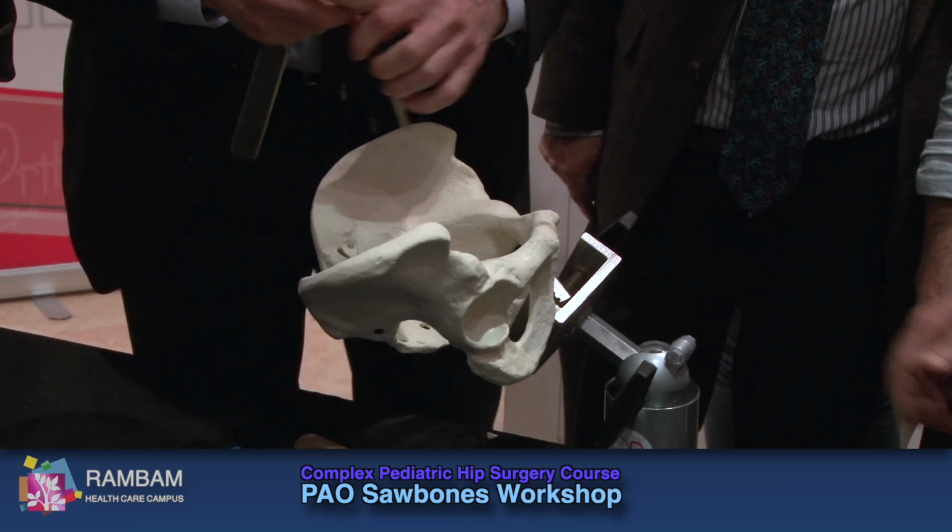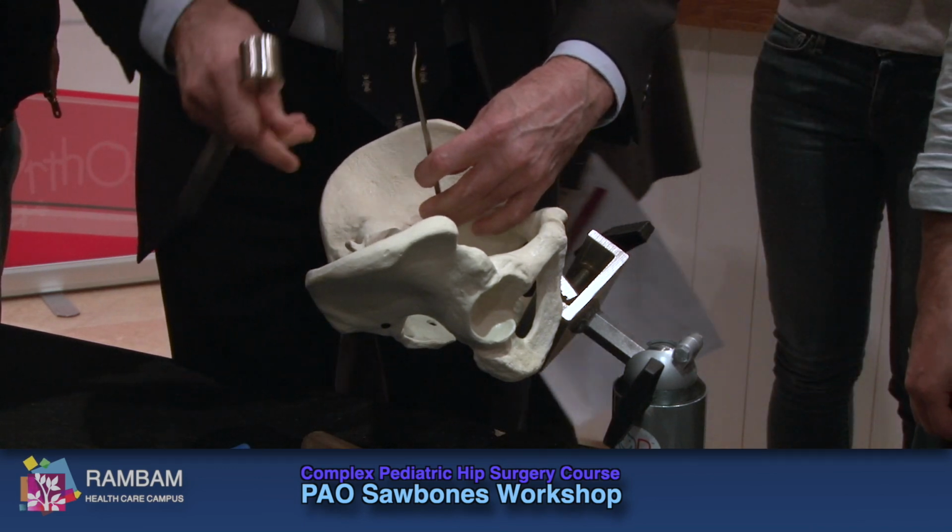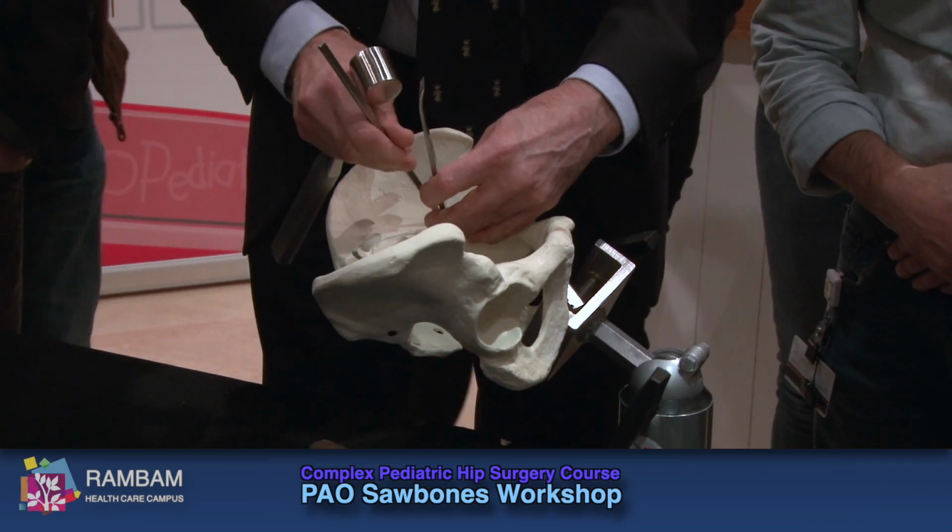Now we need to mark about a centimeter from the brim. So go straight down here, about a centimeter from the brim here. The mark.